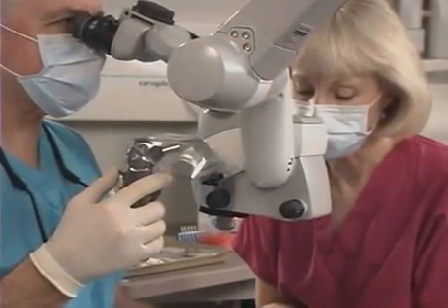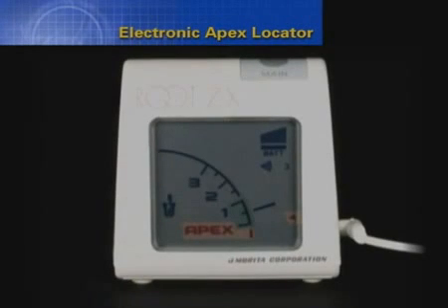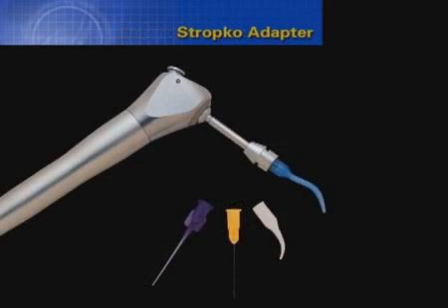The pistol grip handles allow us to adjust the light intensity, focus, and the zoom feature. A well-angulated radiograph provides a 2-dimensional image of a 3-dimensional object. As such, electronic apex locators can more predictably tell us the exact position of a perforation defect. The Stropko 3-way adapter inserts into a triplex syringe, and its distal end contains luer lock threads to facilitate attaching specific tips. This device can be set up to be pressure regulated and serves to collimate both water and air when managing perforation defects.